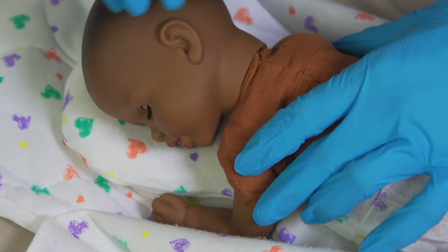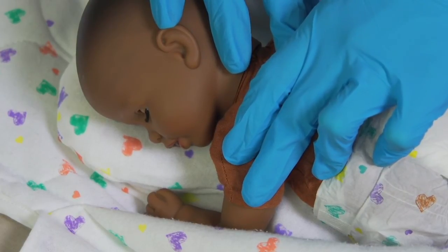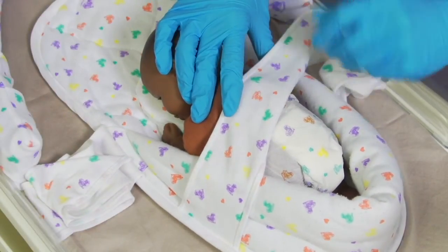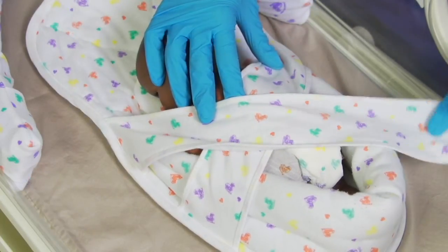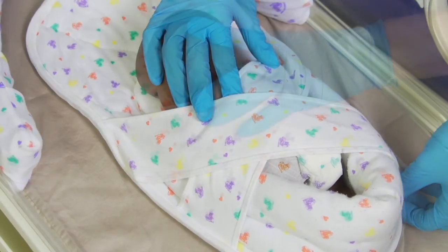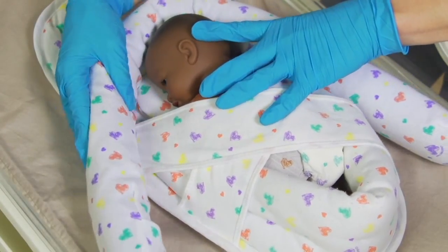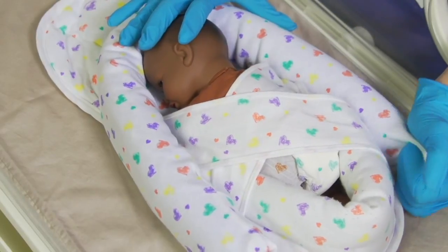The elbows should be tucked into the indentation on the Prone Plus to support rounding of the shoulders and hand-to-mouth movement. Adjust the straps to provide containment, while also allowing for dynamic movement at the hips first, then shoulders. Moving slowly, following the infant's cues, round the bendy bumper to rest against the infant's head to comfort and contain. The bendy bumper continues around the back and outside of the Snuggle Up.